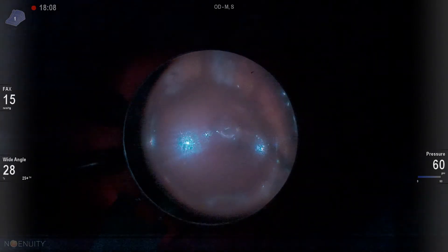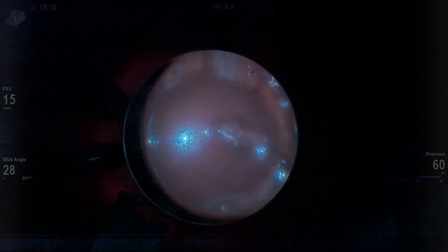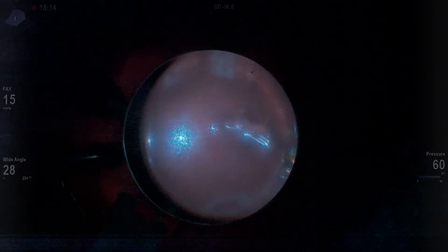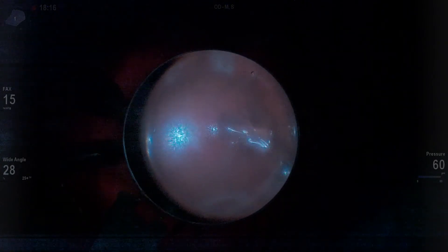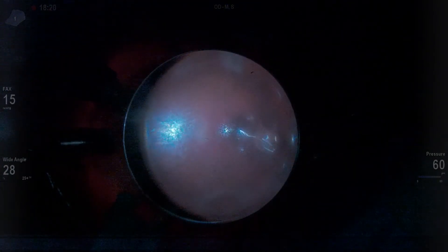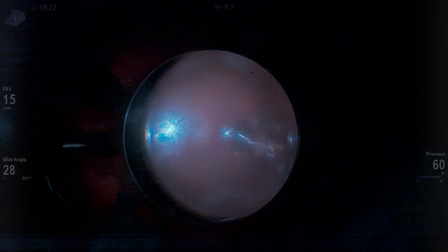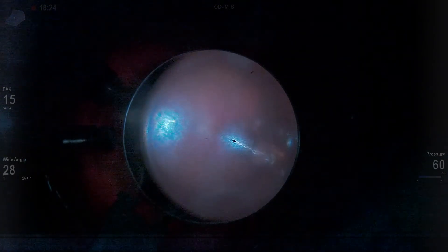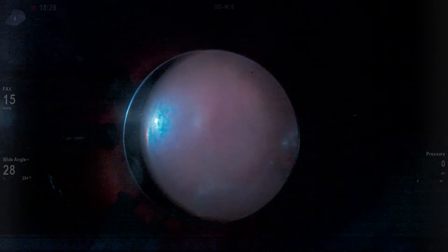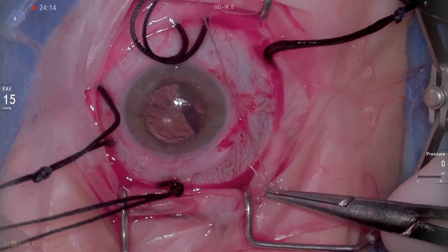I always watch the oil go in the eye, and that's a real critical thing. Years back, I didn't do that, and I had an infusion of oil into the suprachroidal space. We were fortunately able to get it out, but it never left me that you should always watch the oil go into the vitreous cavity. And I'm really glad that we did that here for what we see in part two.